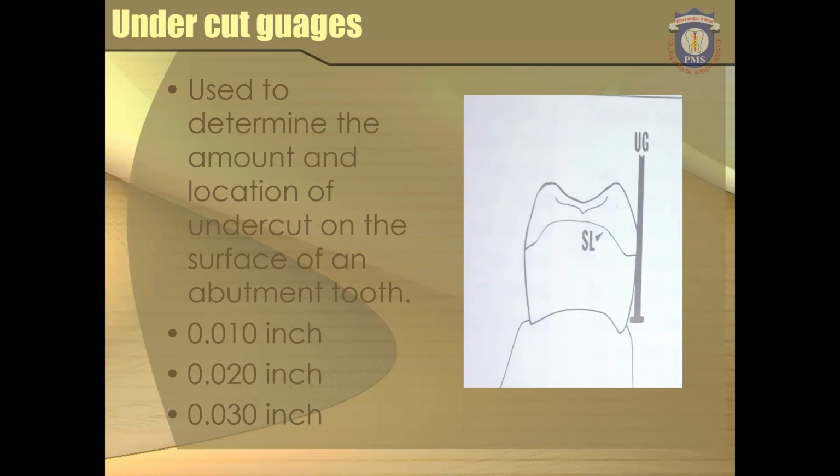The retentive terminal of the clasp will need to go through an entire deep area before coming out of the tooth surface. So there will be excess stress and strain in the clasp.